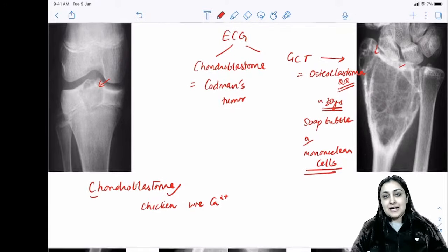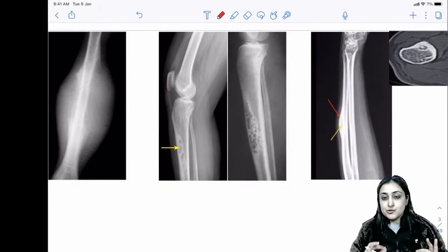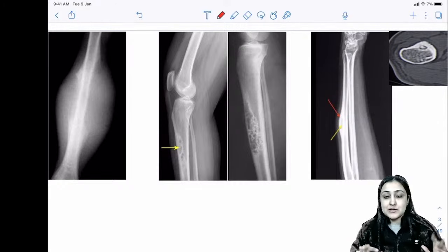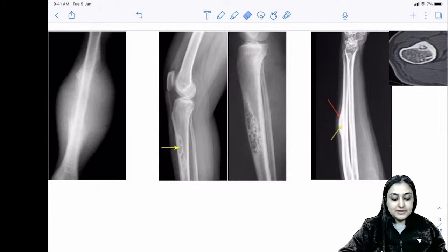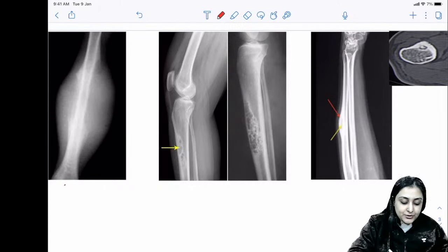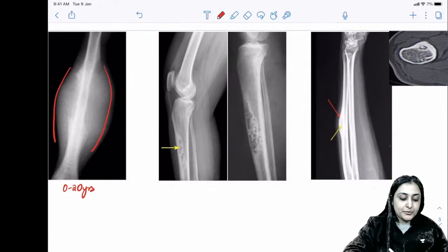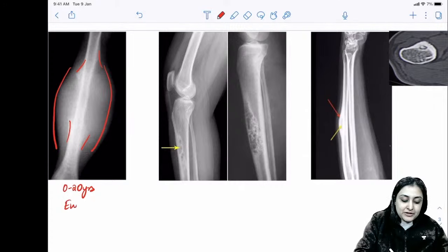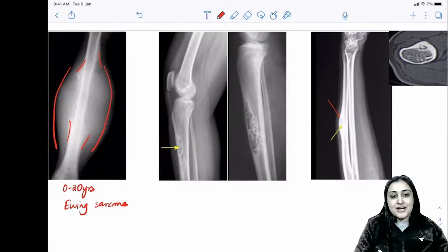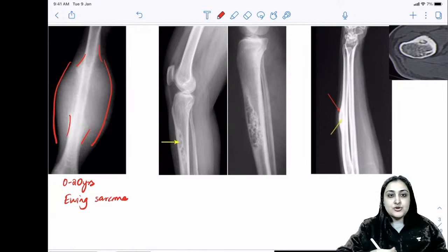For diaphyseal tumors, remember three tumors starting with vowels — vowels stick together. When you see a child in the zero-to-twenty age range with a very large soft tissue component and an interrupted periosteal reaction, this is always a bad periosteal reaction of an aggressive tumor — this is Ewing's sarcoma.